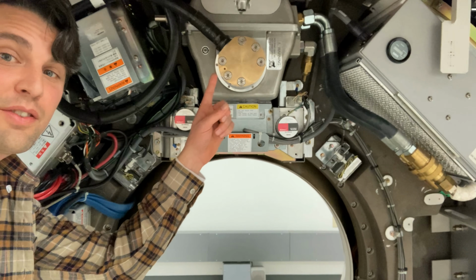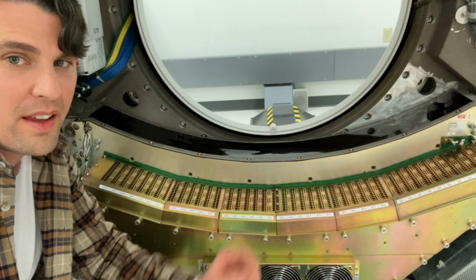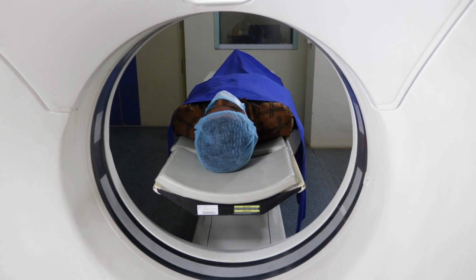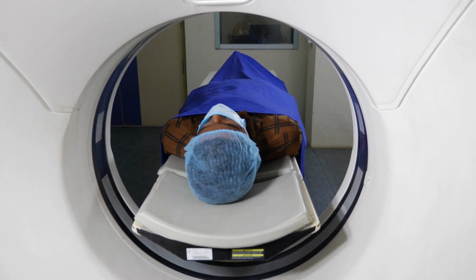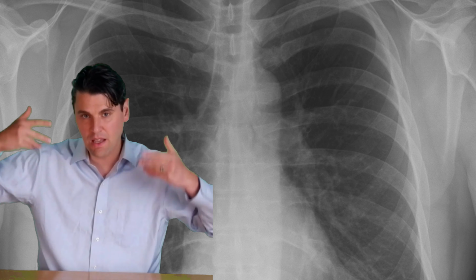All CT scanning is basically you set up an X-ray tube, the X-rays pass through the patient, and they get measured on a detector. You might even have multiple of these on a gantry at one time. But the idea is that you can have motion so that you can scan the whole object. And what we're talking about today is the way in which we can cover the whole anatomy of interest.